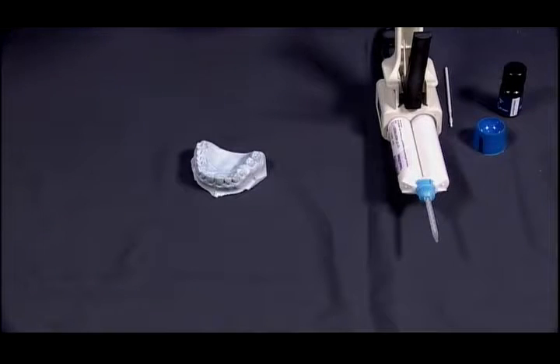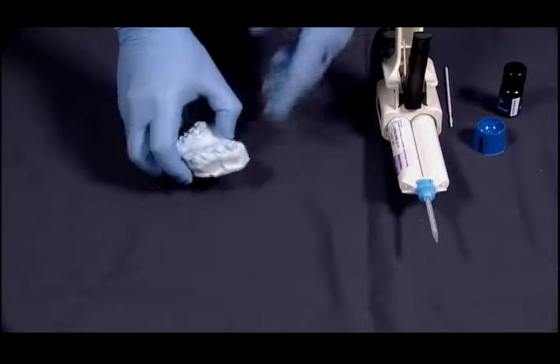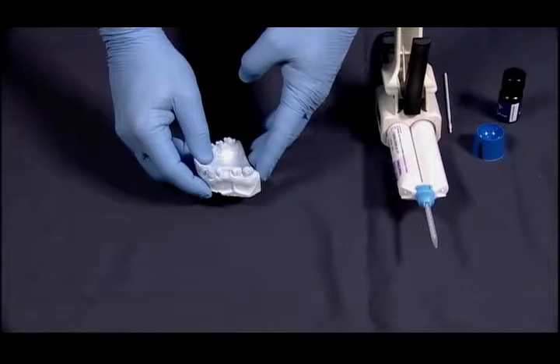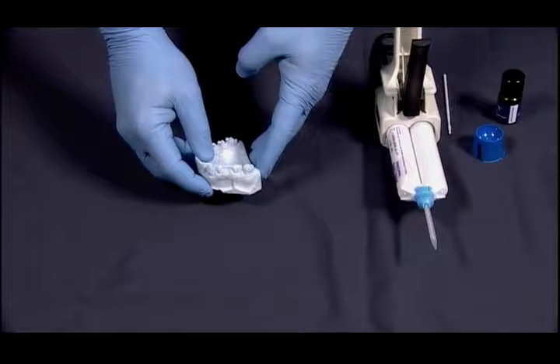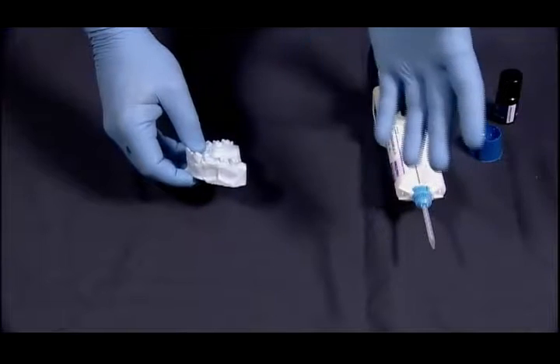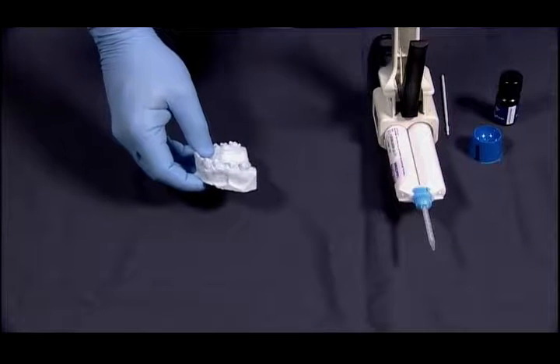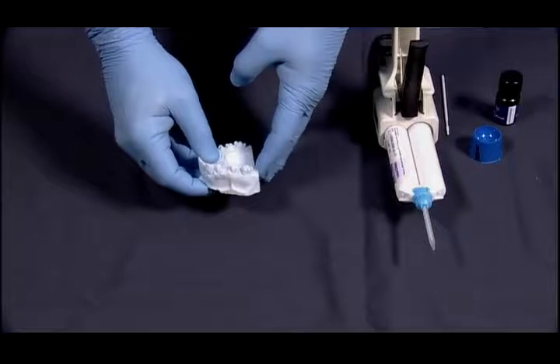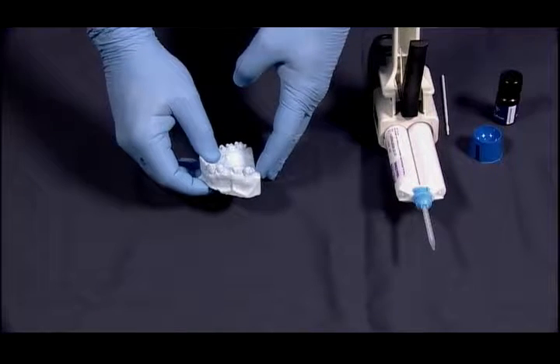We're going to be fabricating a temporary crown utilizing the direct crown temporary crown shells. This particular case is a 3-unit bridge restoration, a temporary restoration. The patient at this point has had the preparation done, and we are now going to do the provisional temporization right in the patient's mouth.